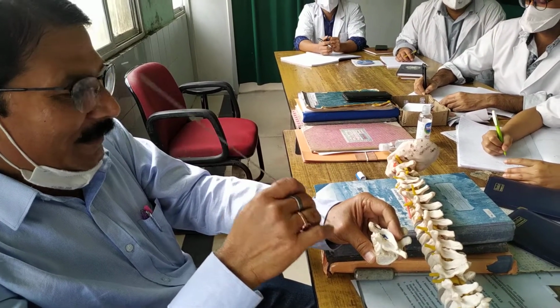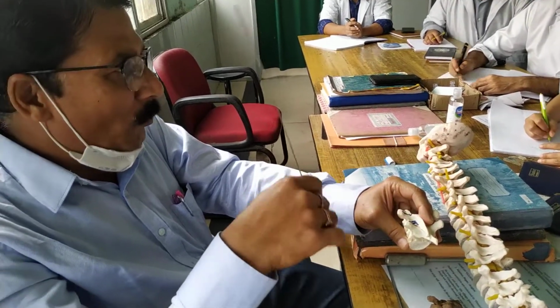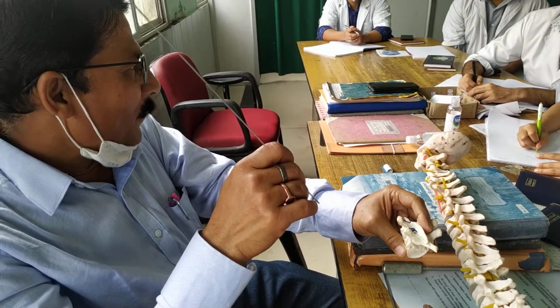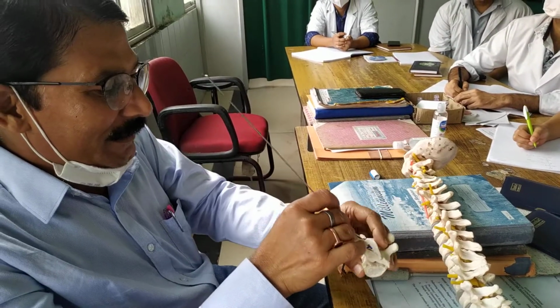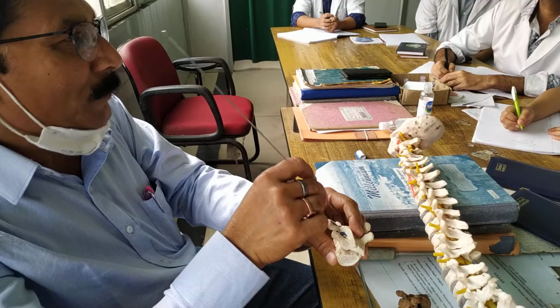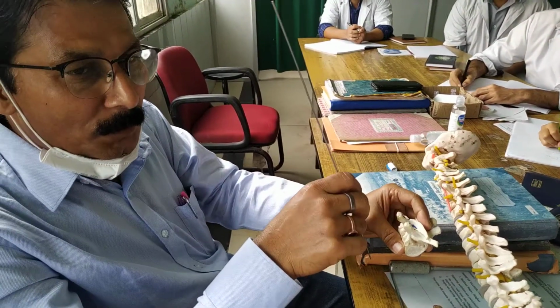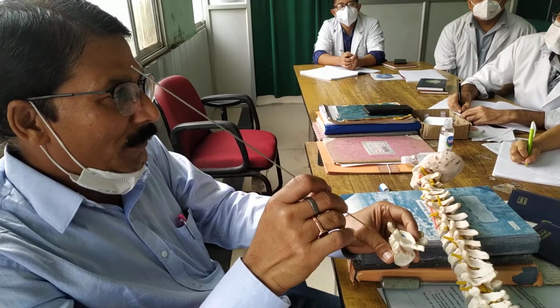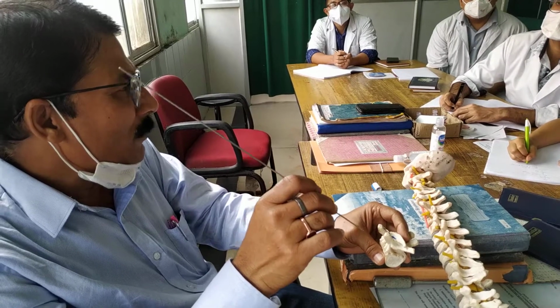Yes. Next point, one should feel all the borders, the walls of the tract you have made, with a sound. So you put the sound inside and scratch it like this, and find out that you do not have any soft feeling. You are supposed to have a gritty feeling all over. A soft feeling means something is wrong.